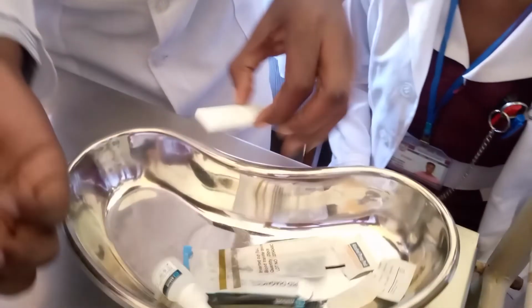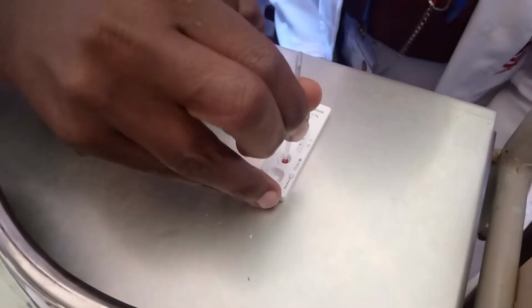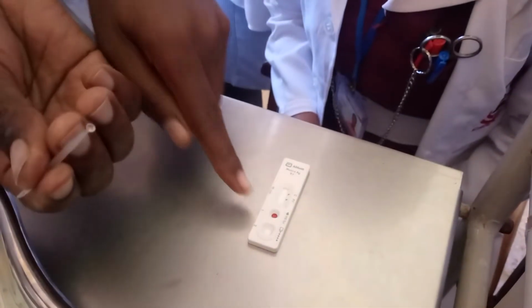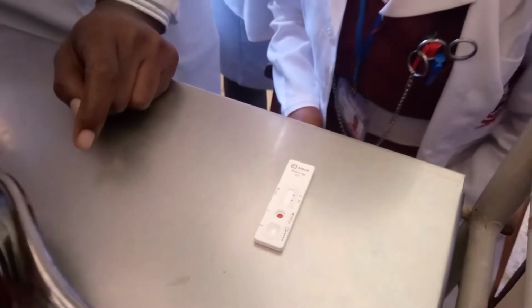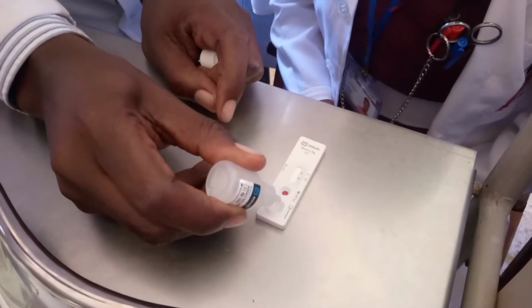So after that, you're going to get this here, the kit. Then just turn it and do that. Once you do that, meaning, as you can see, blood has moved out from the cup, it is there. So you quickly get the diluent and put 2 drops. Okay? So you can put 2.